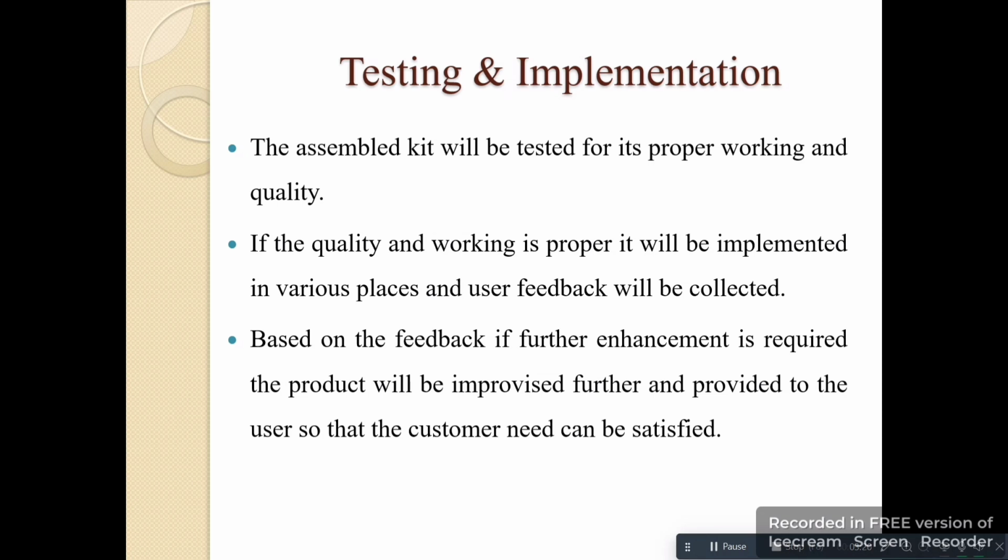Testing and implementation. The assembled kit will be tested for its proper working and quality. If the quality and working is proper, it will be implemented in various places and user feedback will be collected.